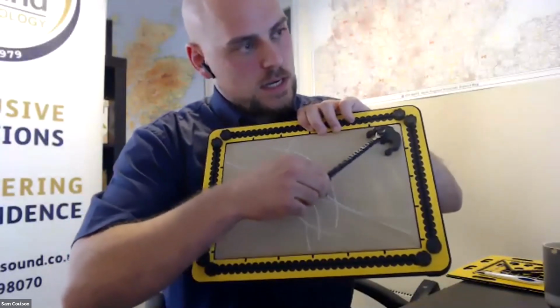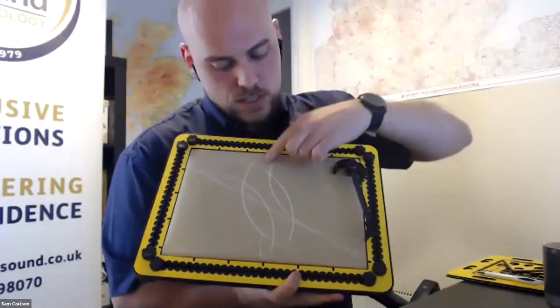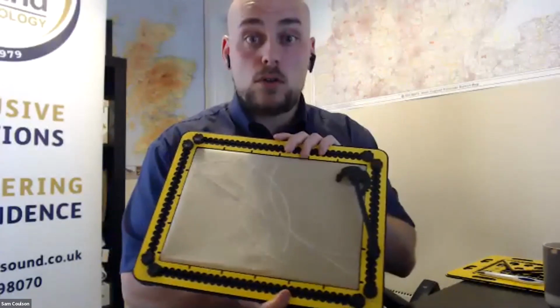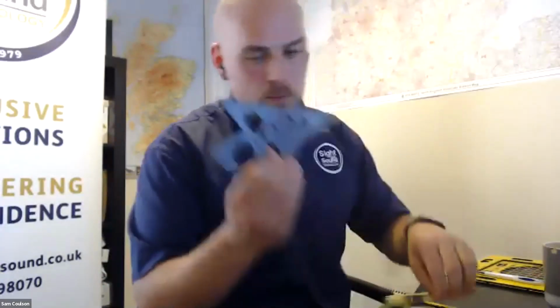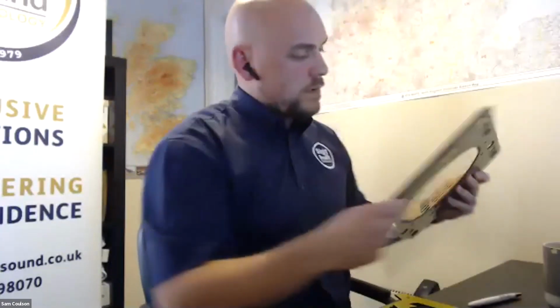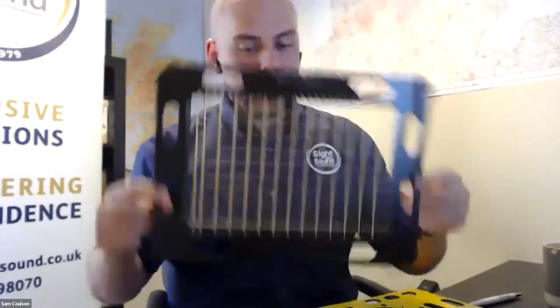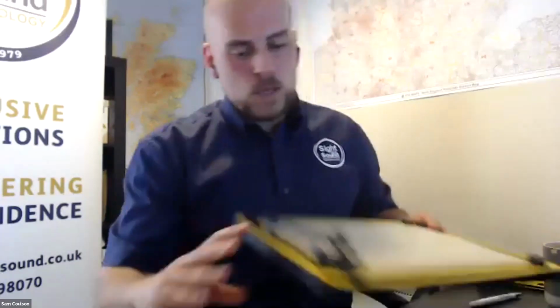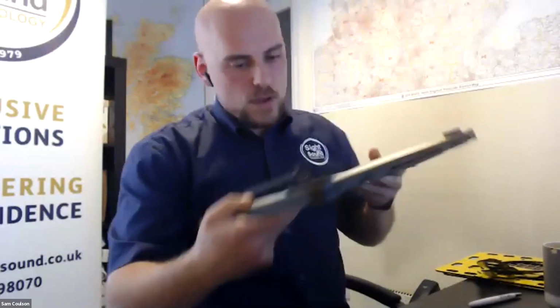What I can do is emboss a line across the TactiPad. You can see there it's embossed very clearly. So it's perfect for creating drawings or charts and graphs, for instance, for lessons. There are a number of tools that it comes with. You've got a protractor, for instance, and other drawing tools. Additional tools, for instance, include a graph grid. This will attach to the drawing board, and the elastic bands will allow the student to draw lines more neatly, or to guide themselves around the page more efficiently. So that is it in a nutshell. This is the TactiPad, a very neat little drawing device, and no electronics in sight. I'm just going to reshare my screen with you all.